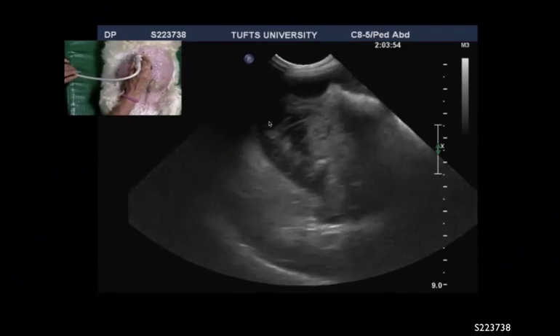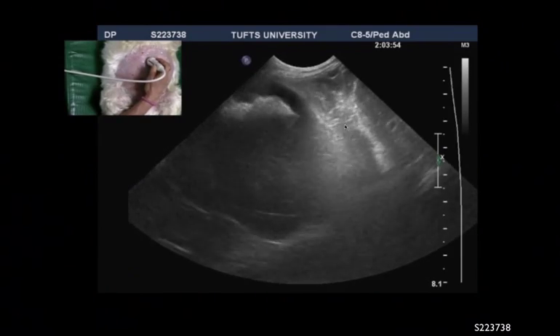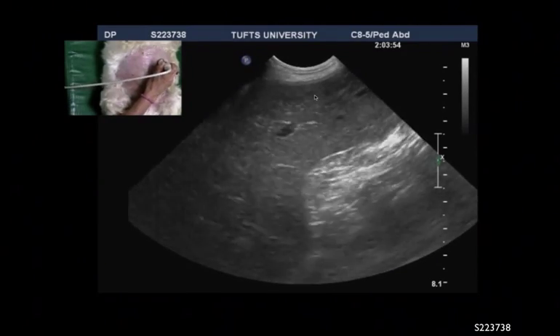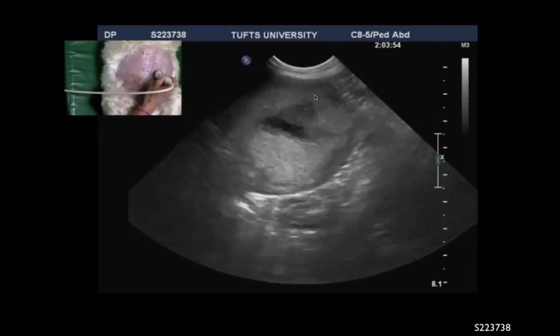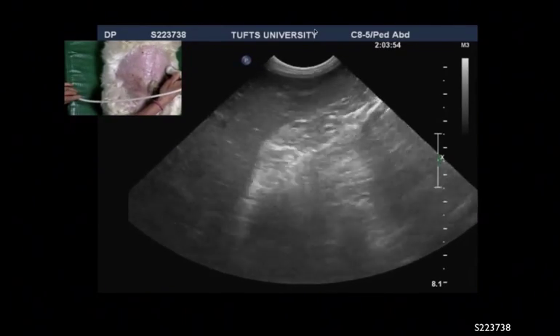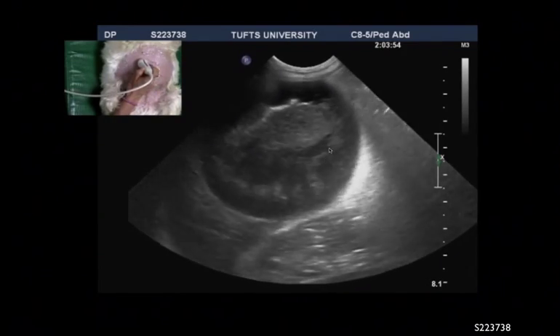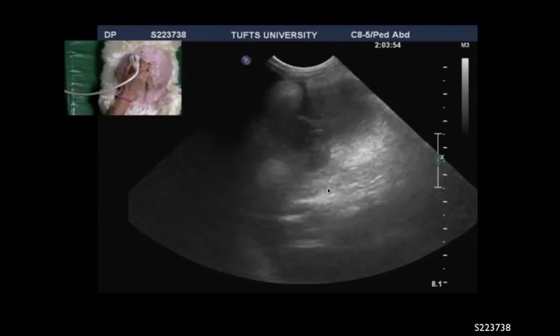We are trying to evaluate all the contour of the gallbladder, and now moving towards the left side of the gallbladder, we move the probe 90 degrees to a longitudinal scan and assess similarly the liver, the large liver mass seen on the left side, as well as the gallbladder, which remains in a rounded shape despite having switched its axis to longitudinal.